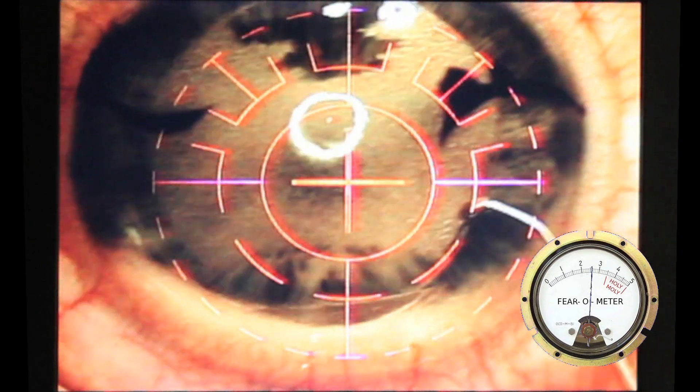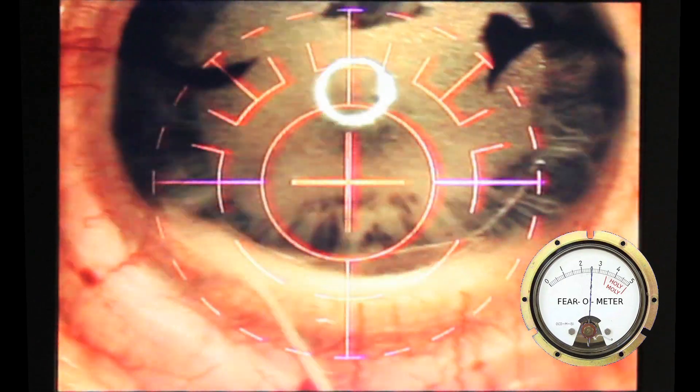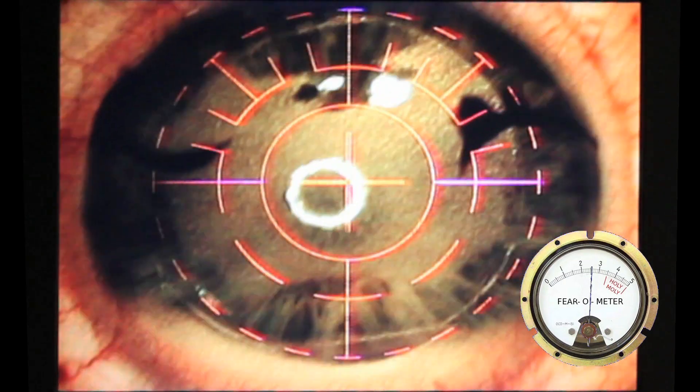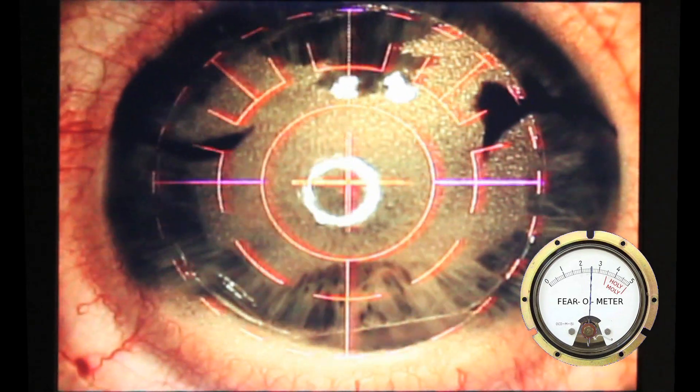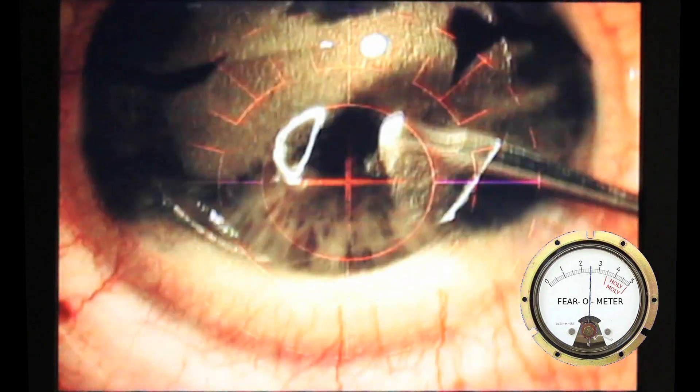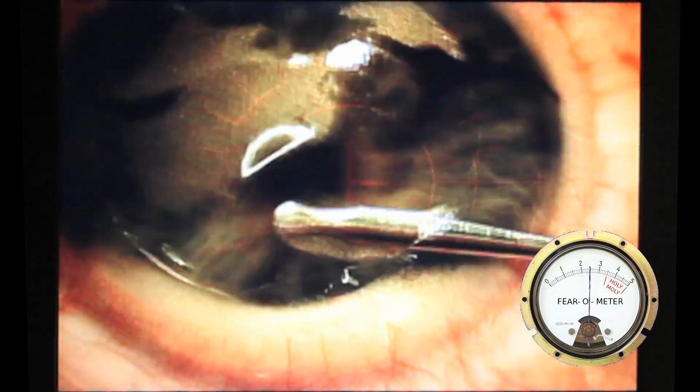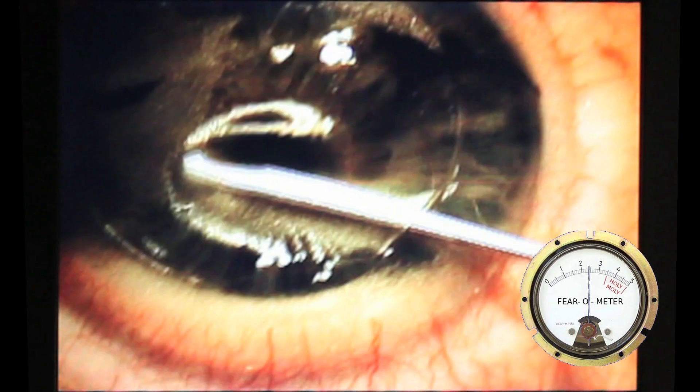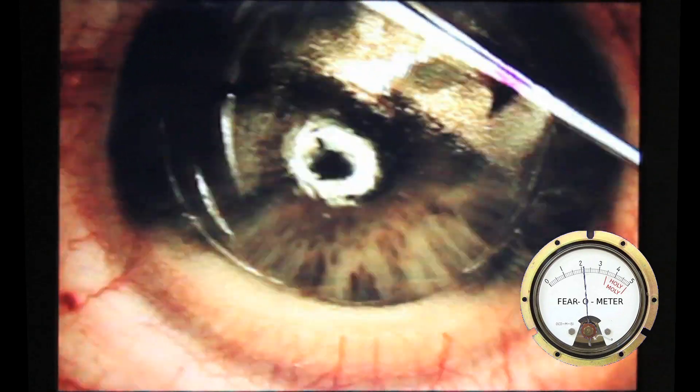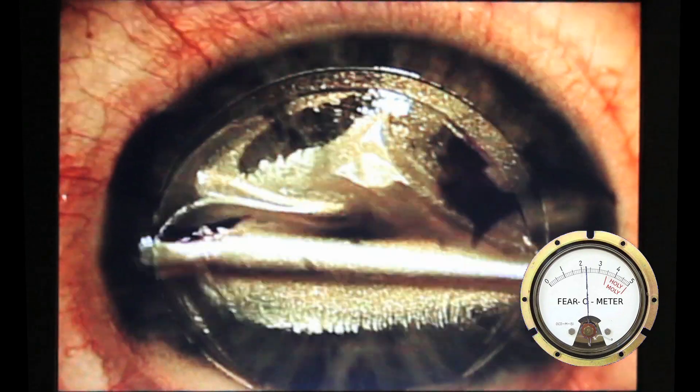So then he gets up under there with this little shepherd's hook looking thing. And he pulls the flap back. And this is, man, this is the part where you're really glad that your doctor's not an alcoholic or has jitters or anything like that. So, anyway, he pulls the flap back ever so gently. This part is really weird. I mean, this weirds you out. I just can't describe how weird this part is.